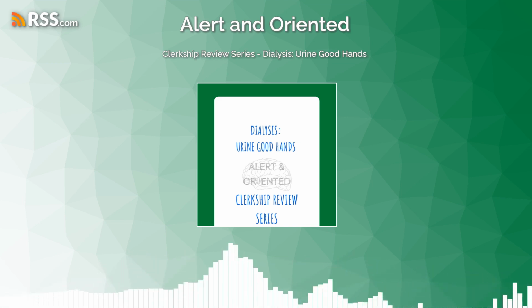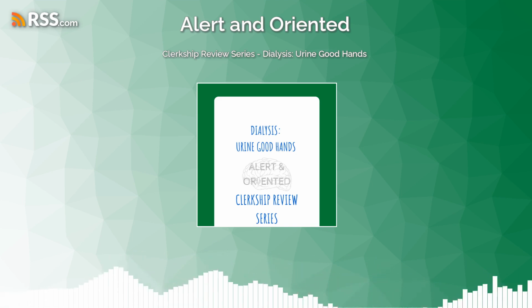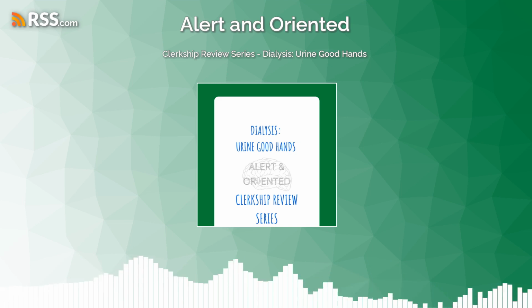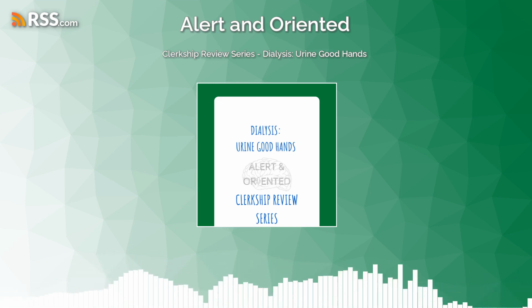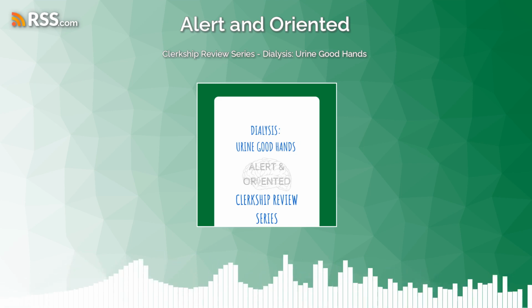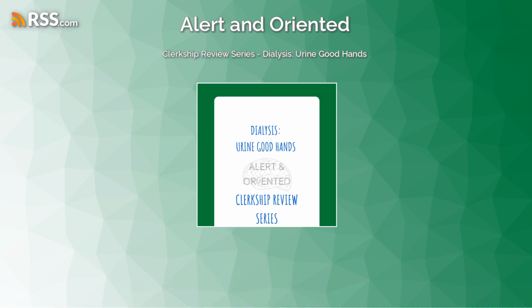The opposite of continuous therapy would be intermittent hemodialysis. This is what most institutions use. This is what's used on the general medical floor. This is what's used in the outpatient setting. This is a 3 to 5 hour treatment using a diffusive modality of clearance. That's called IHD, or intermittent hemodialysis, or for short, just HD.